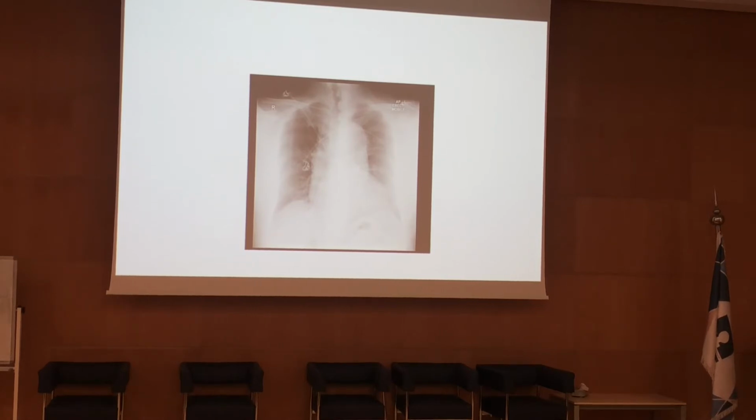What about this? Is it a pacemaker? There are leads. You can see there are leads, probably ECG leads. So you see 1, 2, 3 here, and 4 also here. There is one here. So these are ECG leads. What else? Heart size. Yes, you don't see it very well, to be honest. Here, this is the heart from here to here. This is the edge. Something more important, very critical.